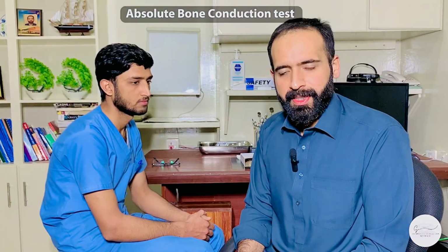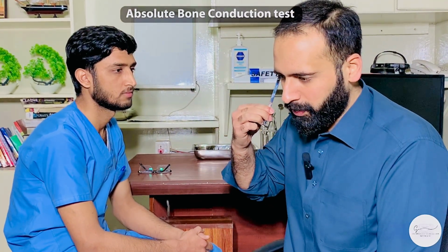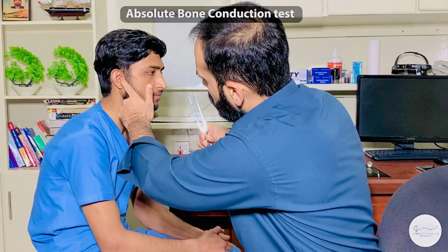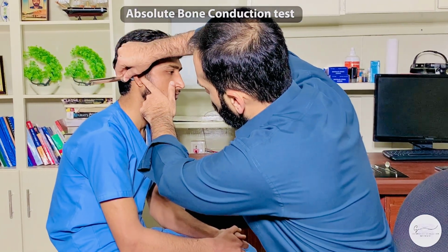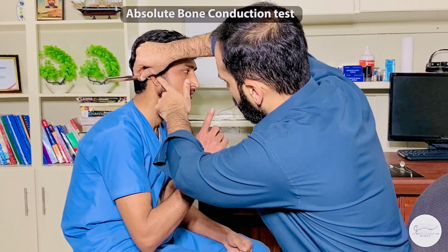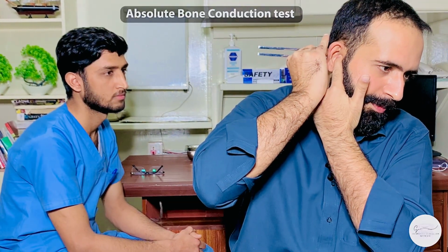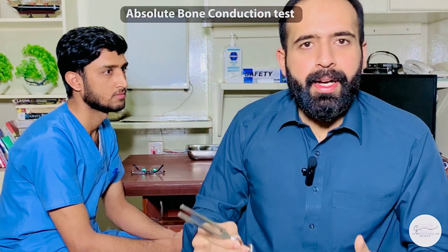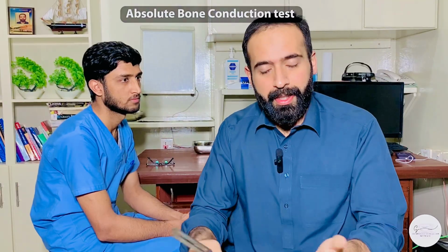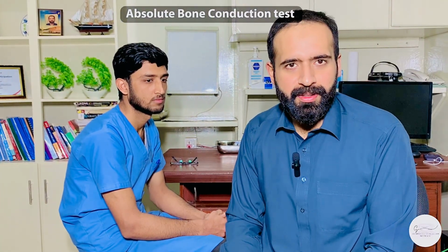Now let us perform the test. Again, strike the tuning fork, listen to vibrations yourself, block the external canal and place it on the mastoid. The patient stopped hearing, so now I will block my external canal and place it on the mastoid. I can still hear the sound. If I can still hear the sound, this means that the patient is having sensorineural hearing loss.